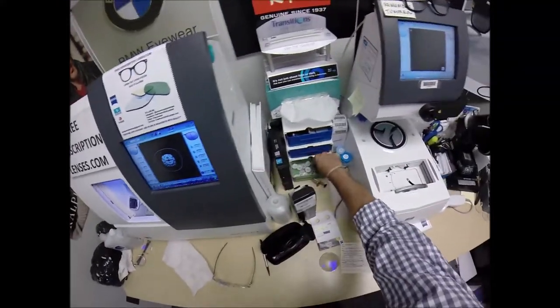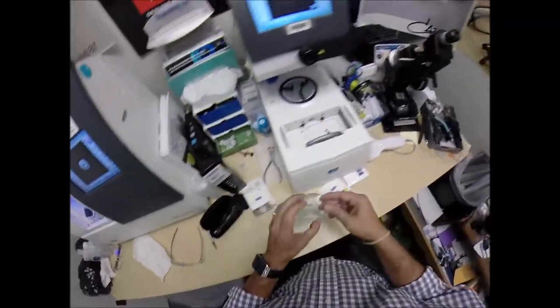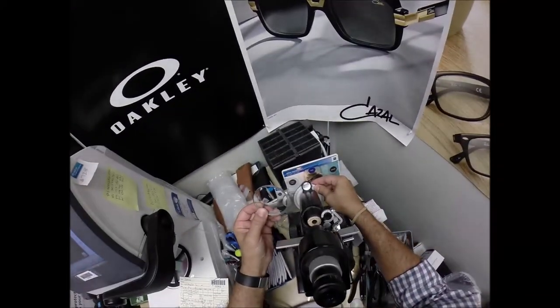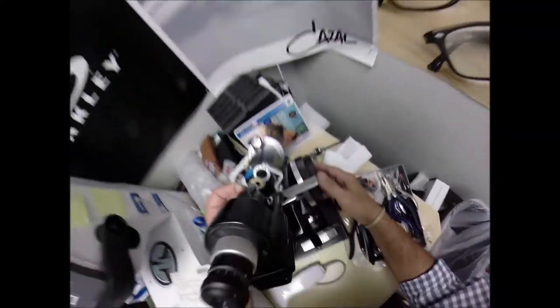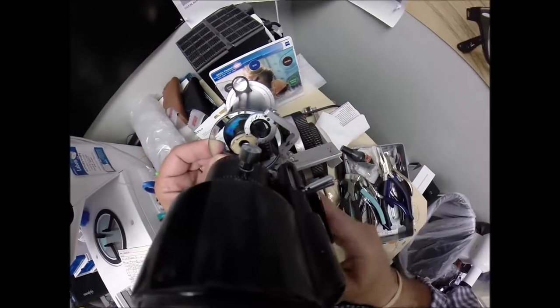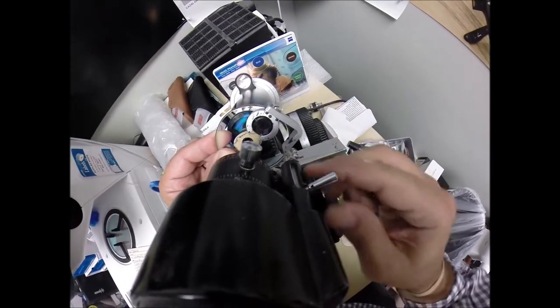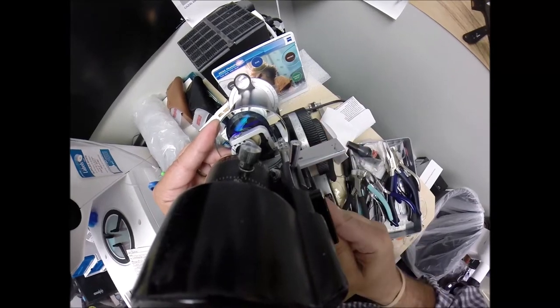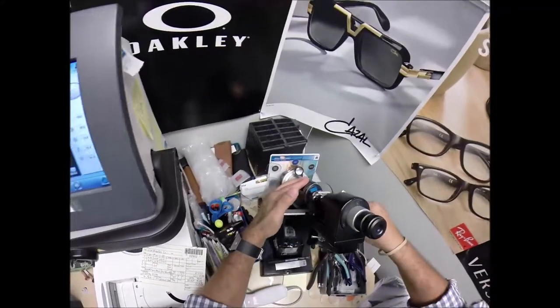Let's grab another one. Here, we've already got the sticker on this one. Let's come back down here to the lensometer. Spin the axis wheel to 75. When I was sitting there playing around with it on the counter. Are you still on 75? 75 minus 6 minus 6. This is something you haven't seen in a video before.